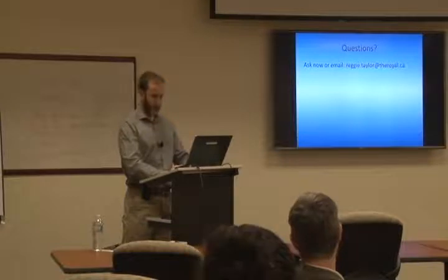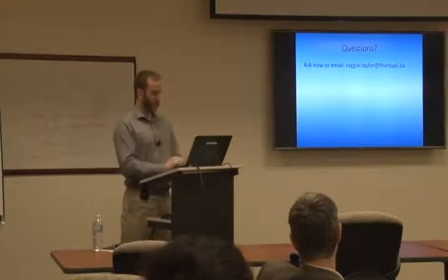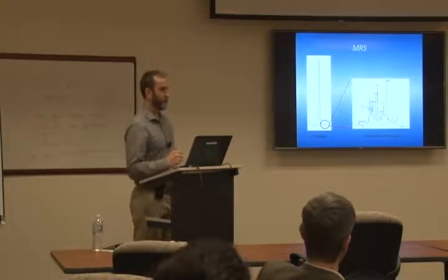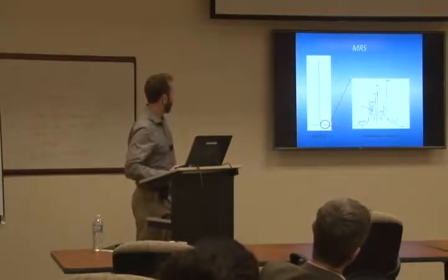How that works is the scale that you're looking at is a PPM scale. And the number of hertz per part per million is going to change as you change field strength, right? So I don't have the scale there, as you can see where I've removed it.